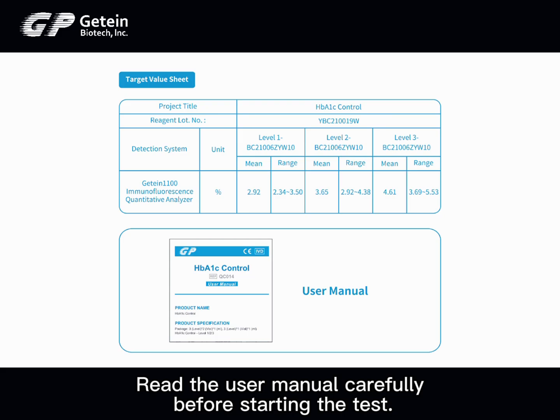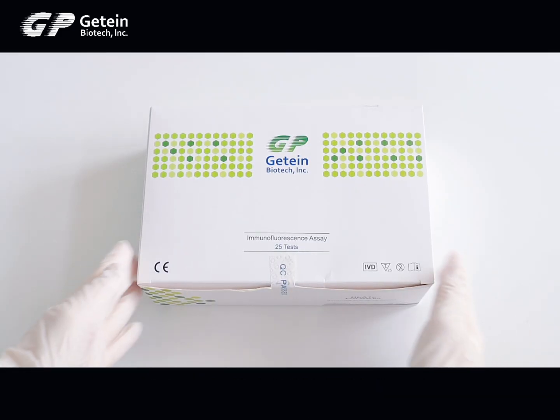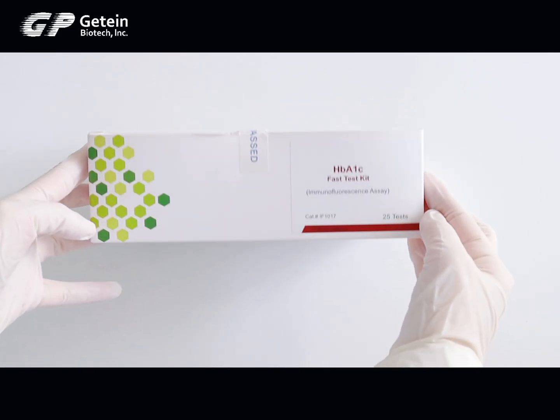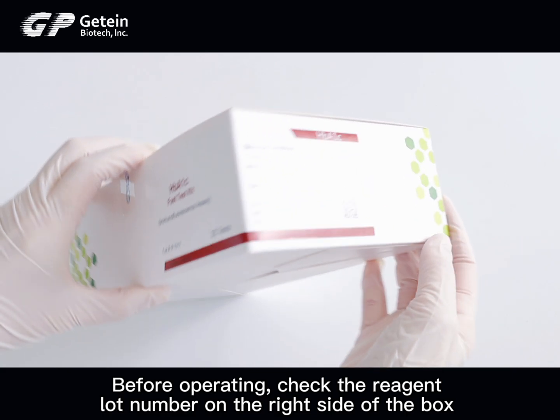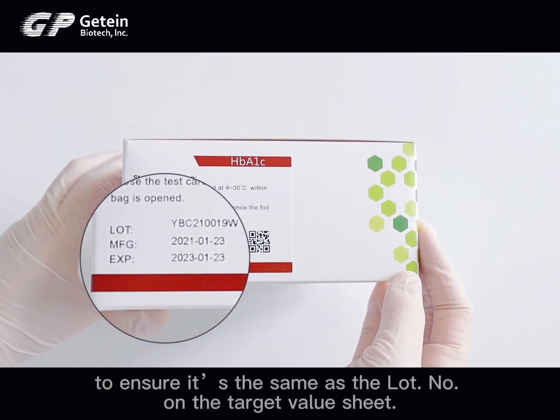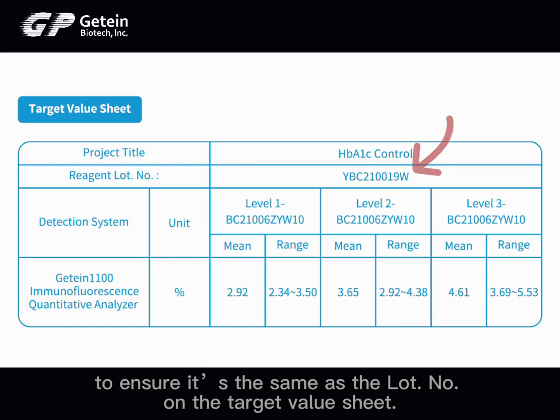Read the user manual carefully before starting the test. Before operating, check the reagent lot number on the right side of the box to ensure it is the same as the lot number on the target value sheet.